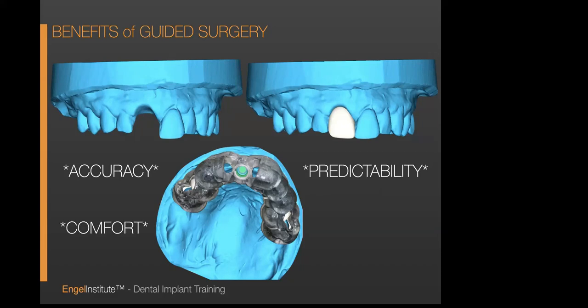Comfort, yes, very, very much so. We can do full arch procedures in under 20 minutes. That's very comfortable. We minimize the interruption of the blood supply. We limit the amount of flaps. We limit the amount of surgical penetration in the bone. We limit a lot of things, and to the patient, that's equivalent to being more comfortable, less medication, less ice, less downtime. So this certainly is more comfortable.